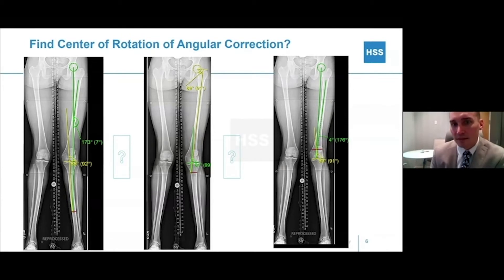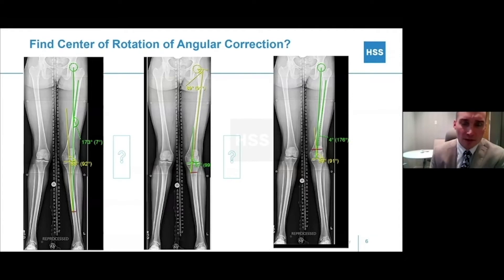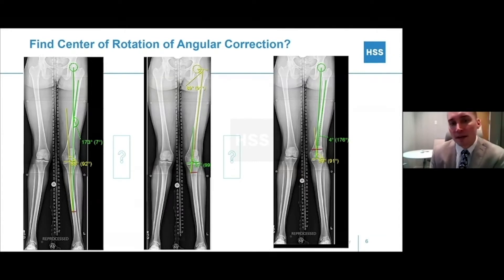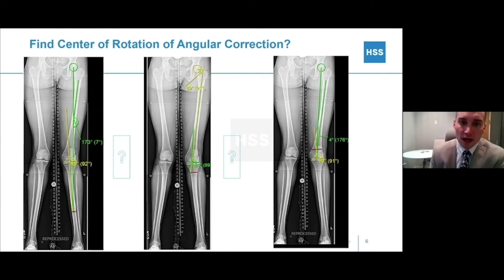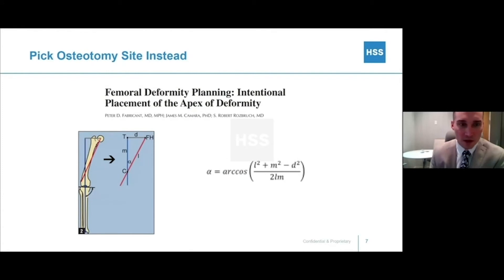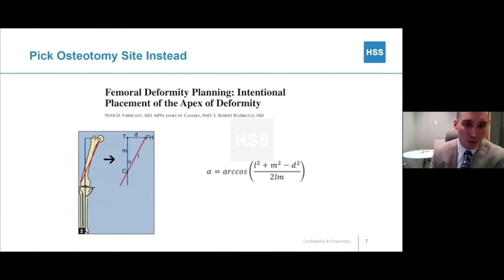Not everyone's bones are the same. This girl is very tall, and her mechanical axis line of the femur is probably only four degrees different from her anatomic axis. Her lateral distal femoral angle — and she doesn't have a normal side since both sides are deformed — is really probably close to this. Once you find the intersection of these two lines, you can see that it's appropriately in the distal femur. Knowing the deformity is in the distal femur, you can plan your osteotomy there intentionally.